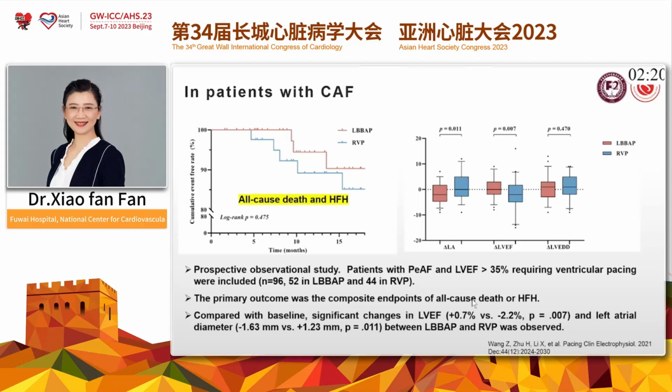Here is another study. Our team investigates the impact of LBBAP on the echo parameters and the clinical outcomes in patients with chronic atrial fibrillation. These patients in clinical practice require ventricular pacing, and some patients underwent the LBBAP, and another group underwent the RVP.